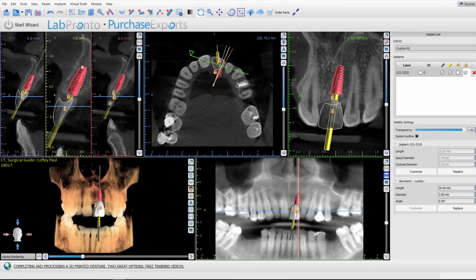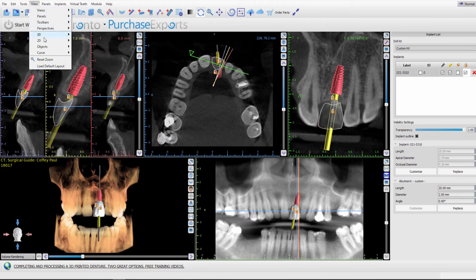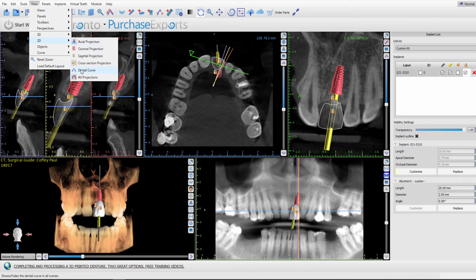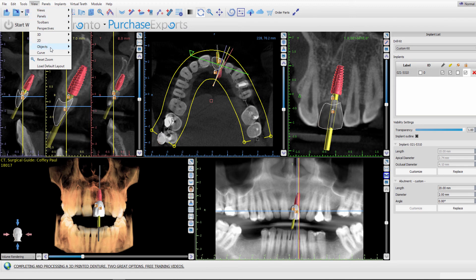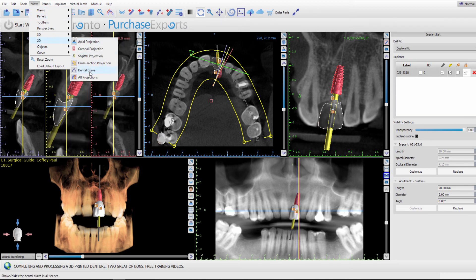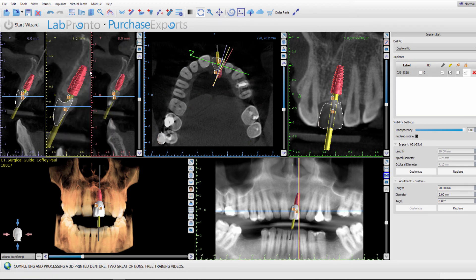If you go to dental curve, you can turn the dental curve on and you can turn the dental curve off.